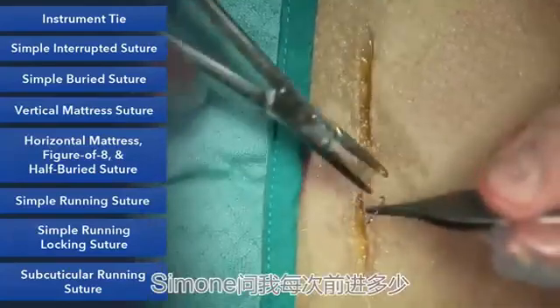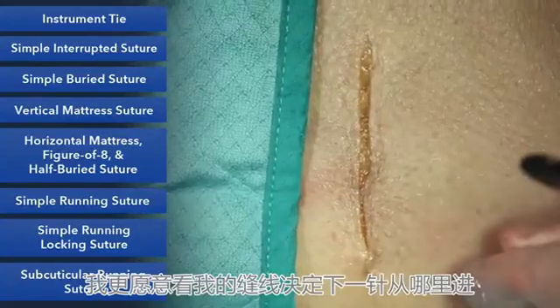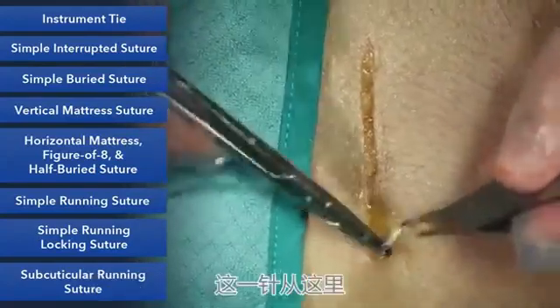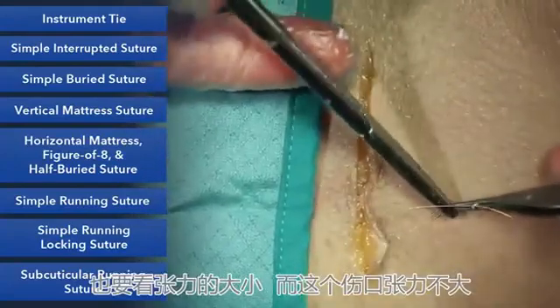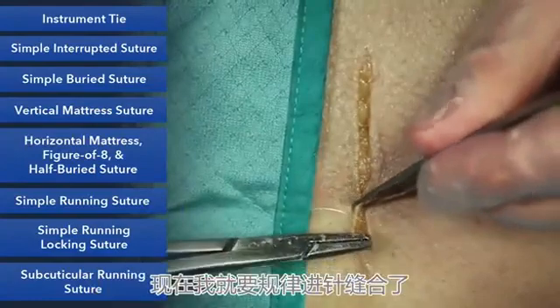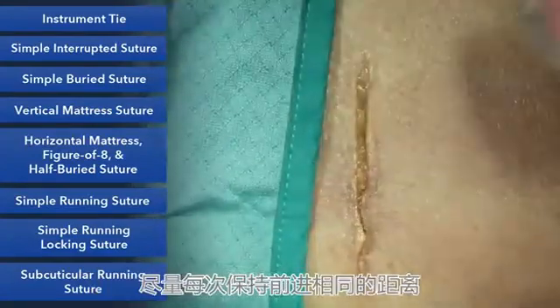Now with this stitch, I'm always asked how much do you advance each time? What I like to do is see here with my suture where the next bite should be, and that's where I'm going to put it. So in some sense it depends on how much tension there is. On this wound, there's not a lot of tension. Now we're going to start to take regular bites on each side. I'm trying to take the same depth and the same amount of tissue each time.